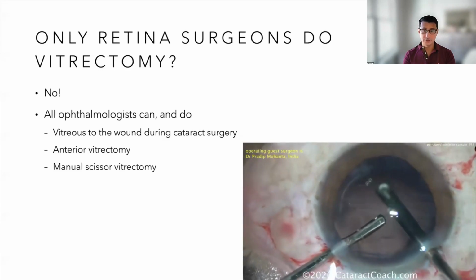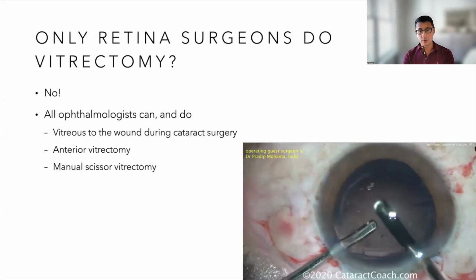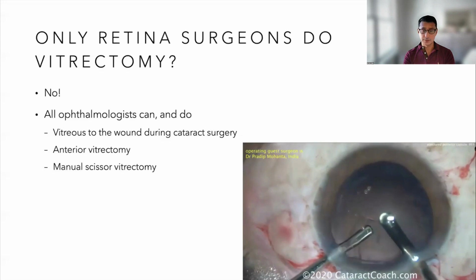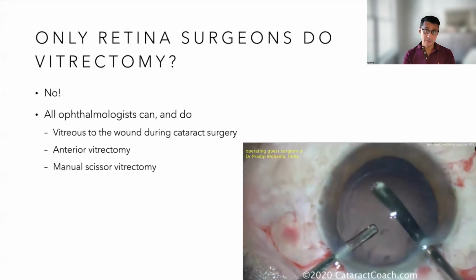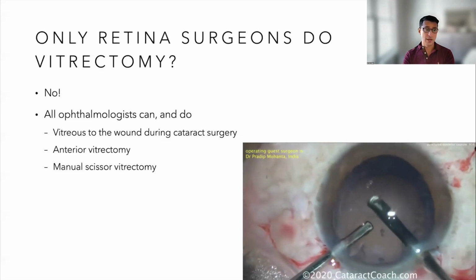And so if you just left vitreous in the anterior chamber after a prolapse during a broken capsule case, it's not just that it's going to interfere with the eye or the vision, it's that you're putting this patient at risk for a retinal detachment. So we have to relieve that traction. It doesn't guarantee that they're not going to develop a retinal detachment or retinal tear, but it dramatically reduces the risk if you can relieve the traction.